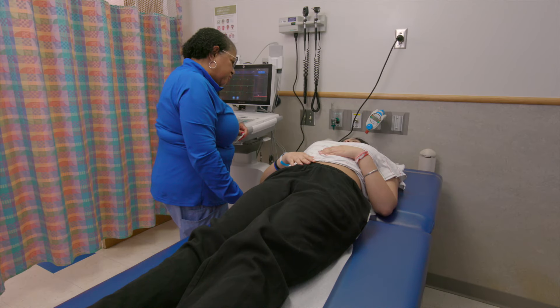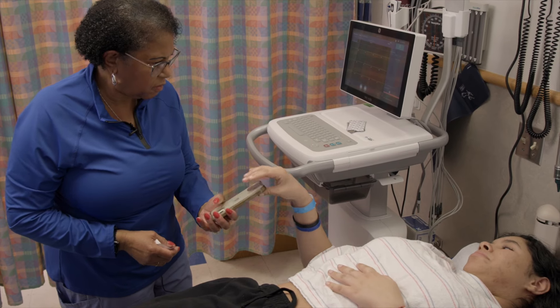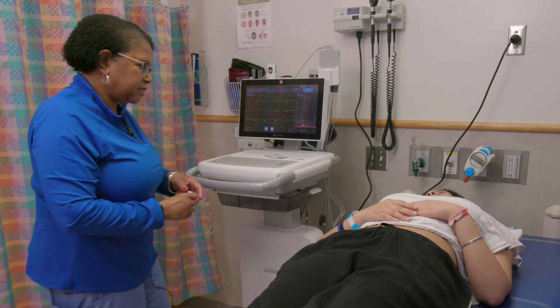Do you have a cell phone in your pocket? Yeah, I do. Can I ask if you — I'll put it over here for you. Okay, wonderful. We won't forget it, okay.